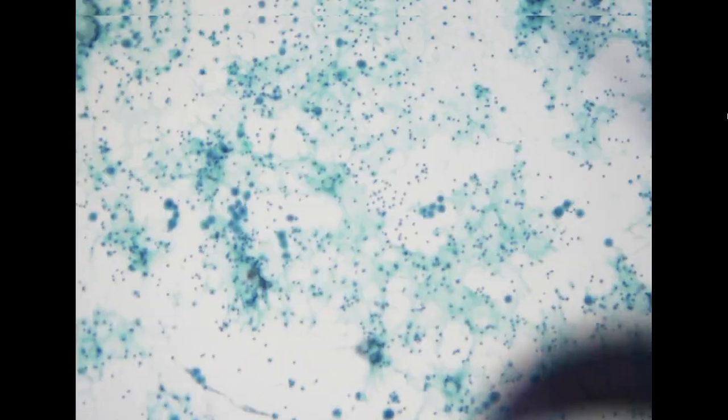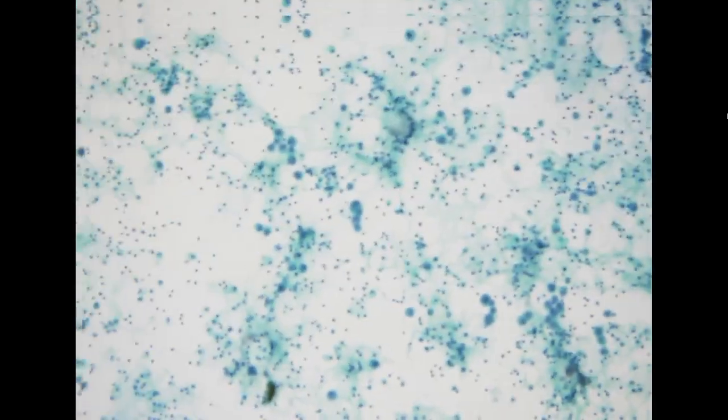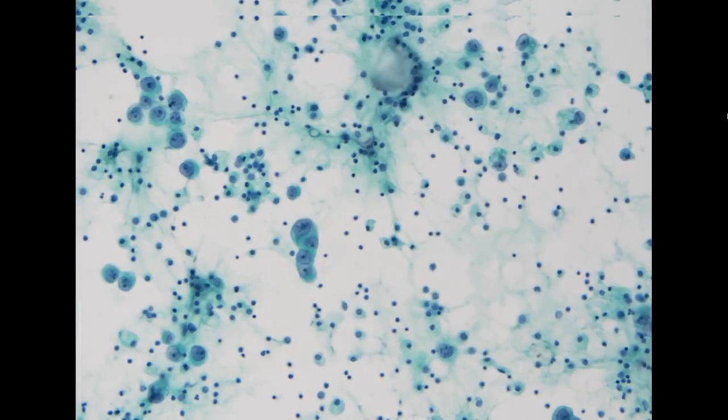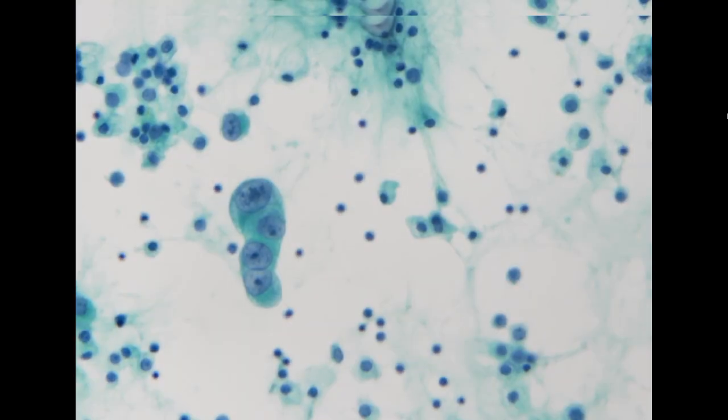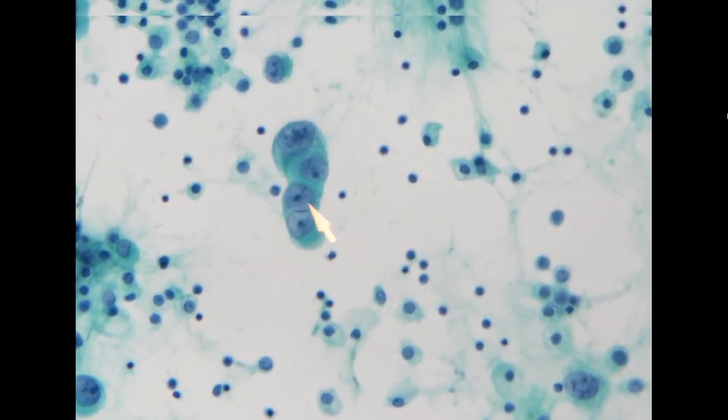Another similar case, again a middle-aged female. In this specimen, the background shows more inflammation. But these bigger cells are still very abnormal.